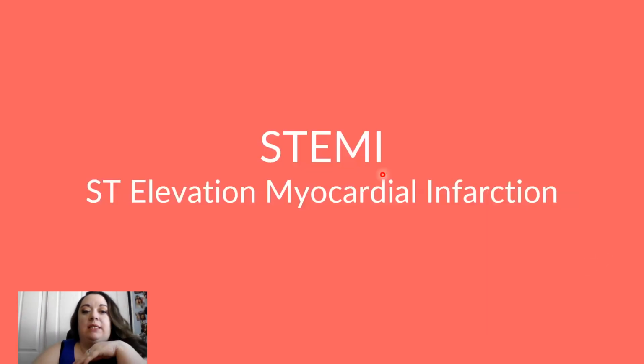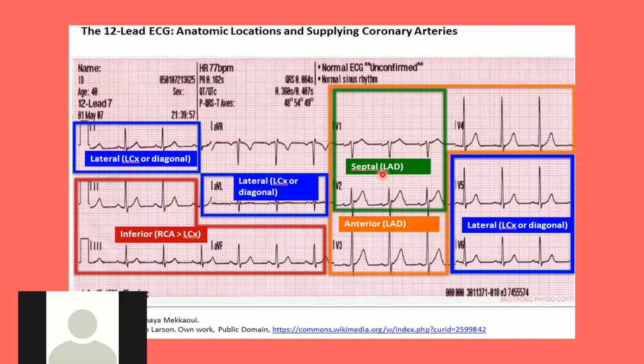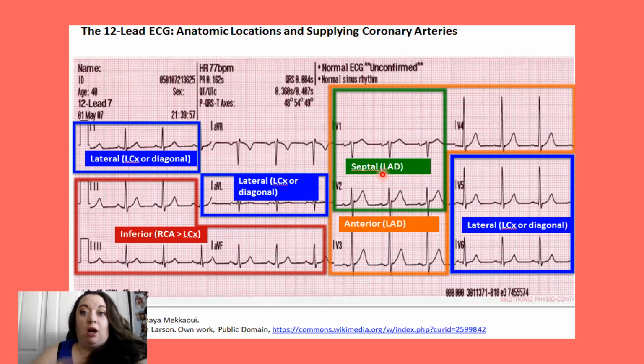Are there any questions on the paper? As nurses, are we going to have to know this picture, what these things mean, or just the physicians? No, the nice part is you don't have to know where all the colored boxes are. If you learn it, awesome. But the colored boxes just let the physician get an idea of where he needs to go, where the heart attack's occurring.